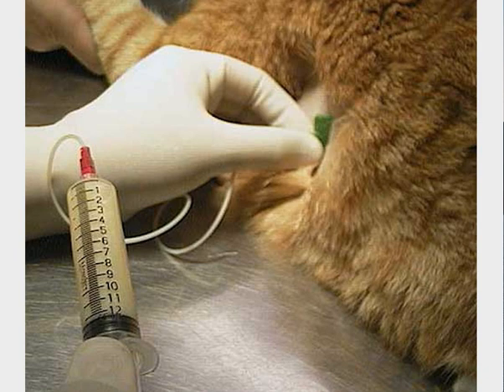And if somebody hands you this syringe of thoracentesis effusion, what are you going to do with it? The first thing you're going to do, just like urine, is evaluate it grossly for color, turbidity, possibly odor, and treat it that way.